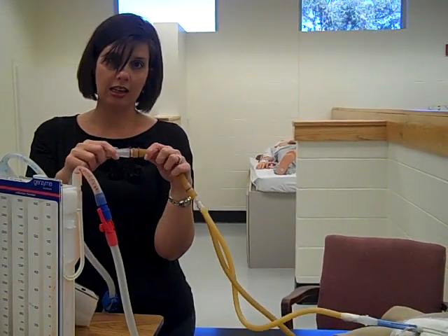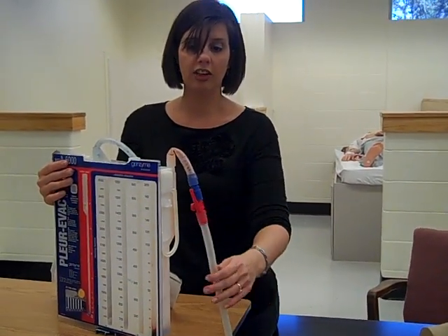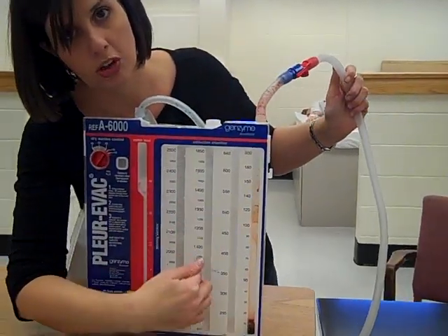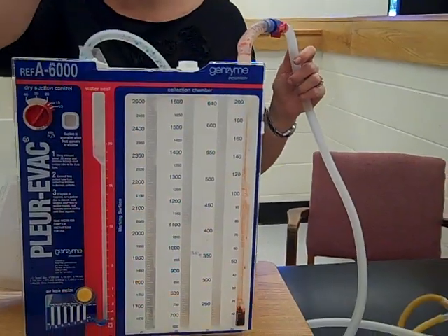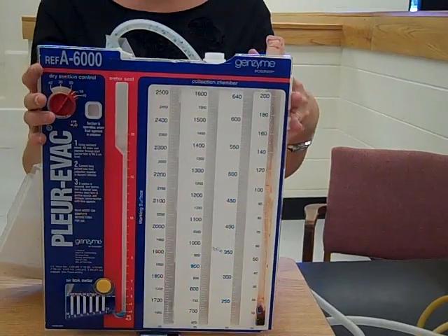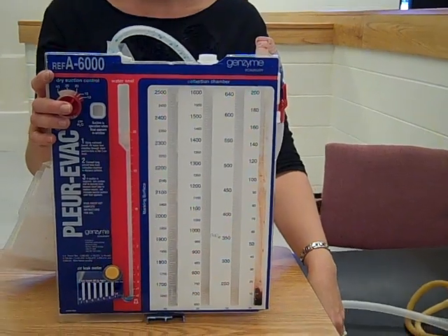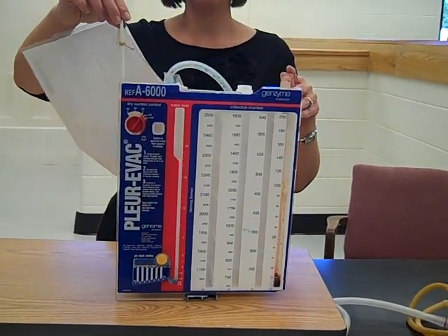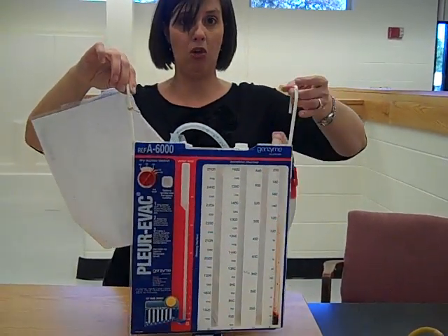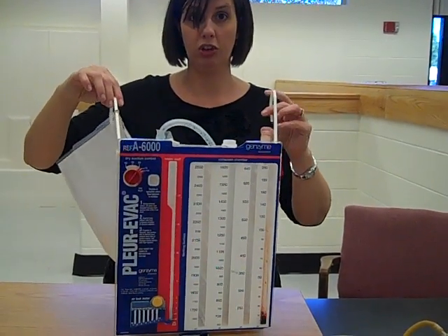Once this is in place and ready to go and you've turned on your suction, you should start to see if there is any drainage accumulating in these chambers here. And this is where you will mark your drainage each and every shift or every so many hours, whatever is dictated. Remembering that this device should never be higher than the level of the patient. This would normally be sitting down low on the floor using securing devices to hook it to the bed frame so that it doesn't tip over like such. But for the purposes of this demonstration, I have it up on a table so you can see.